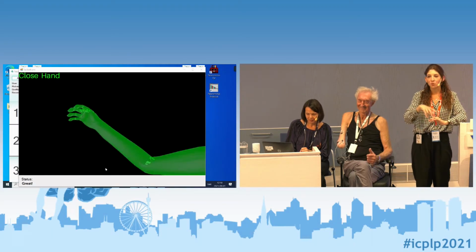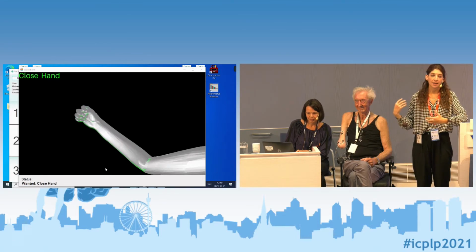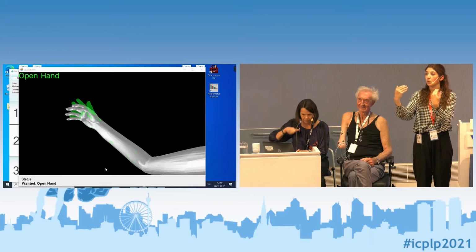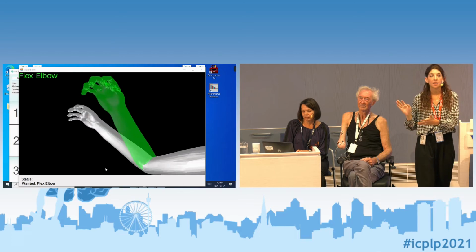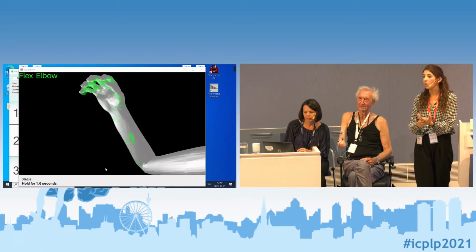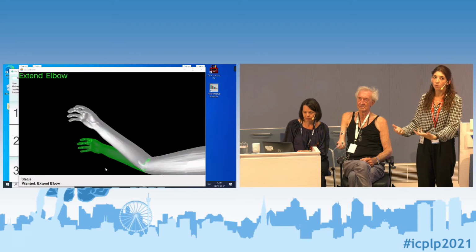Unfortunately, we don't have the time to challenge you to come and try it, but maybe next conference. It's actually quite hard to be able to control your muscles. And another tricky part is to relax. If the patient arrives at the target and keeps contracting, they go over the position. So relaxation is also a really important stage. It's random positions according to the movement that we select, and at the end you will see a final score that is a percentage of how was the performance of the patient. So it's a good indication for you to say, okay, the participant is able to manage these movements.